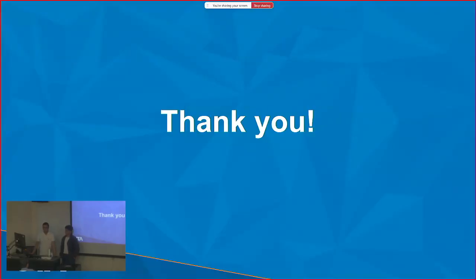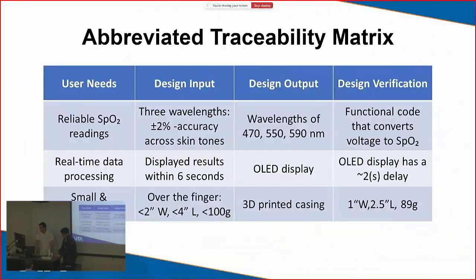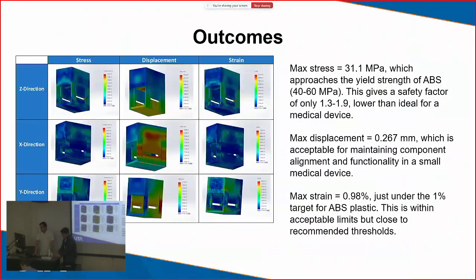Thank you. Good job. Real quick, this is Jeff. On the insertion of the finger, in that hole, is there a spring device or something to squeeze around the finger? I wasn't able to see that. There isn't a spring device. I was considering that with our original designs from last semester. There was a spring device.